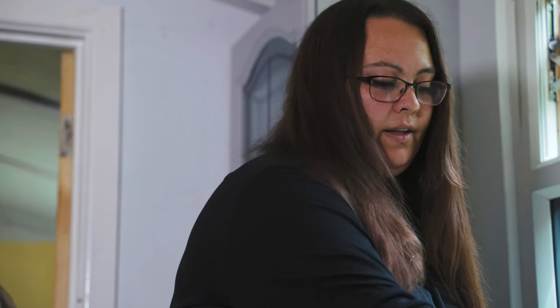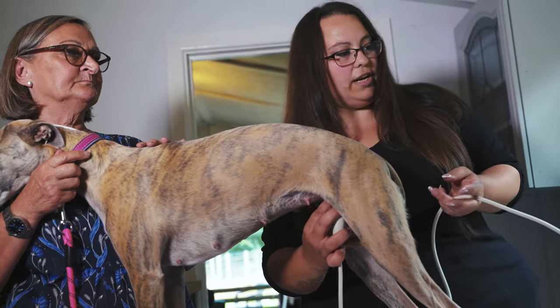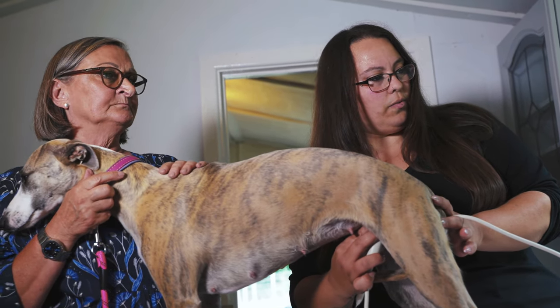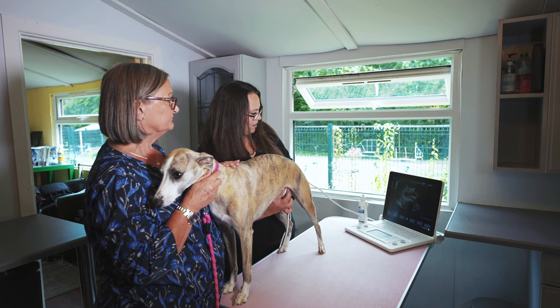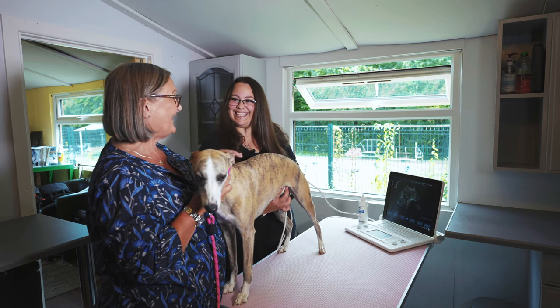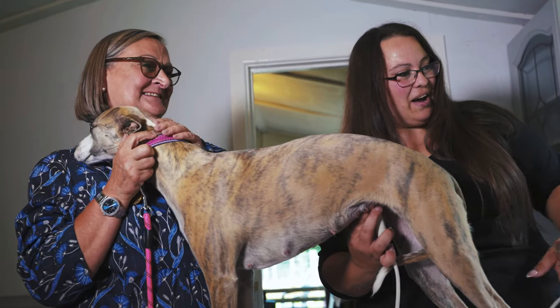Now we're ready to find out if this girl is having any babies. We'll start at the bottom and generally look for the bladder — and yes, we found the bladder. Coming up from the bladder, I can confirm that she is having babies, which is lovely to know.